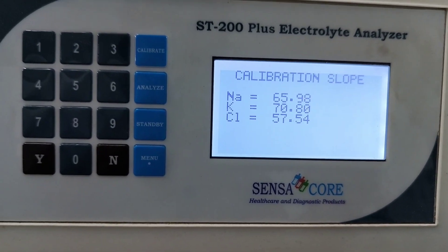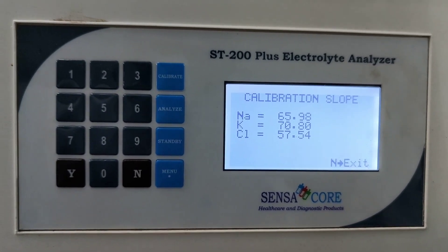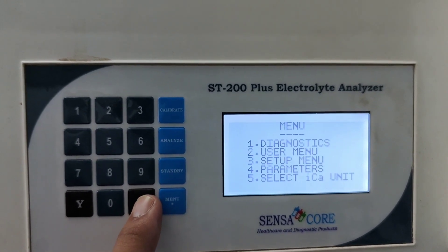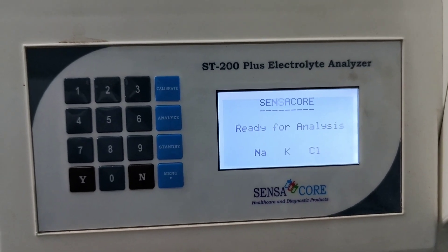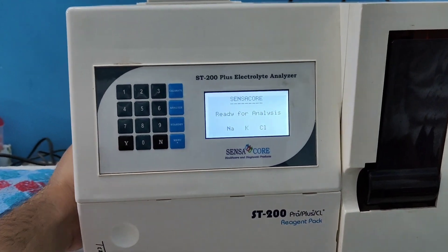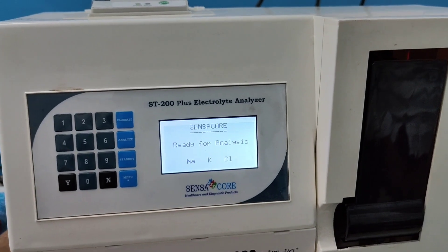You can see it's showing calibration slope. After performing daily cleaning, it gives you the calibration slope. Now this is the ready mode — ready for analysis. Now I am going to turn off the machine as the test is run. Here on the back side of this machine there is a switch. Just pressing the switch, it's going to turn off.